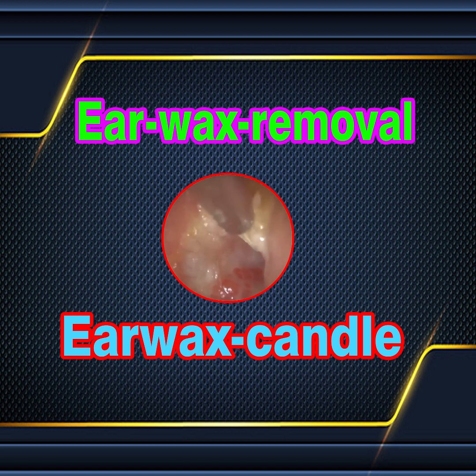So that granular myringitis is mainly affecting what we call the posterior quadrant. Sorry, not posterior, inferior quadrant. The south, if you're looking at a compass, the southern hemisphere. It looks slightly bulged there as well, so there might be some middle ear pathology involvement as well. So the plan of action is I'll write to this patient's GP. I'm going to follow them up, and if there's no improvement after the medication, I'm going to get an ENT referral requested for further investigation and treatment.